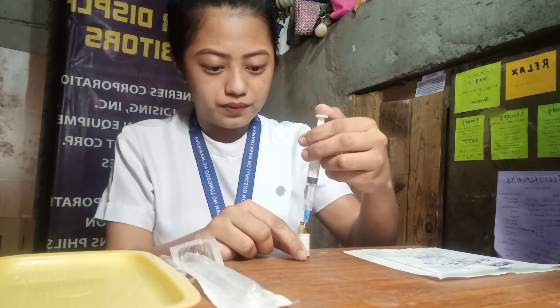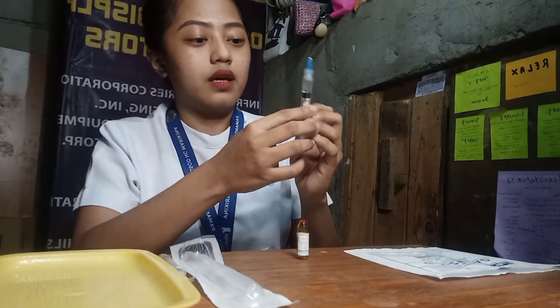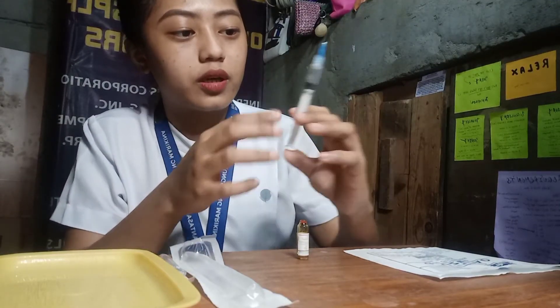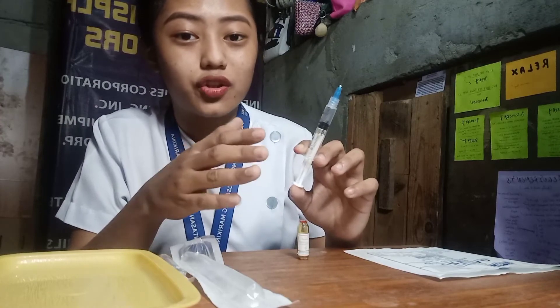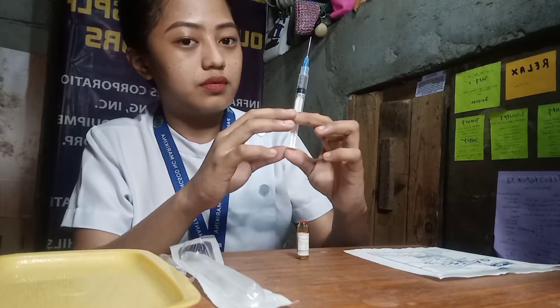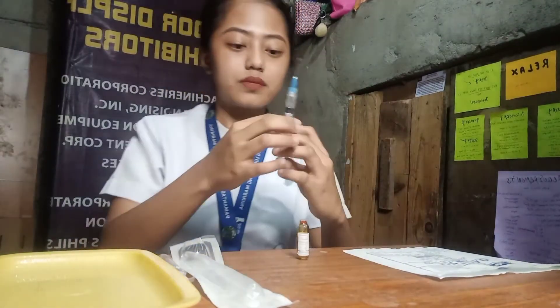We need to remove all of the air bubbles on the top by flicking it using our thumbnail. If necessary, pull the plunger and make sure that there is no liquid going out. This is now our measurement — 1cc.